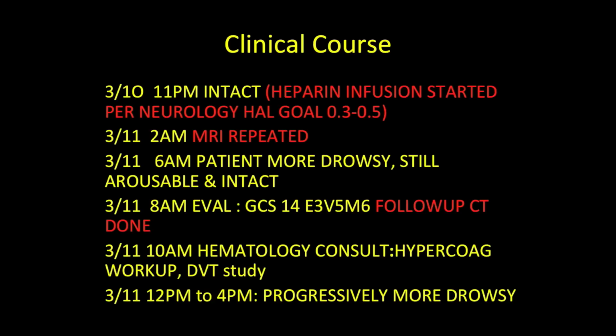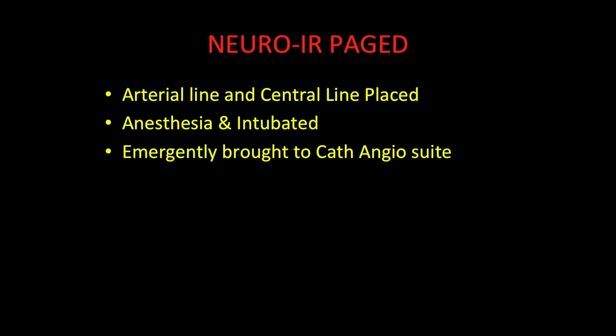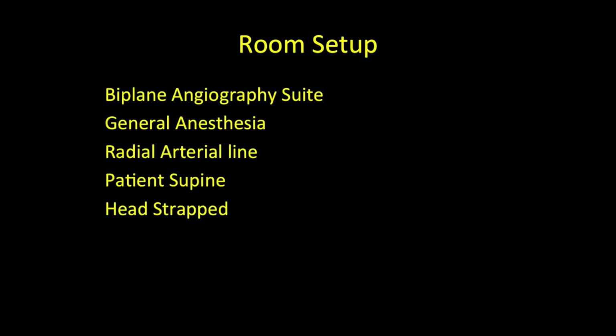The patient, however, clinically deteriorated later in the evening, became less responsive, and therefore the neurointerventional service was paged, and decision was made to take the patient to the cath angio suite after anesthesia, intubation, and placement of a radial arterial line and a central line.